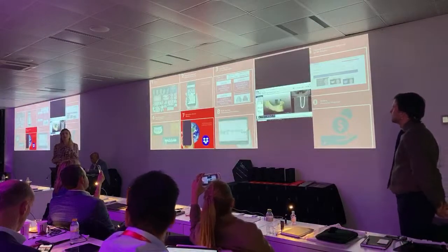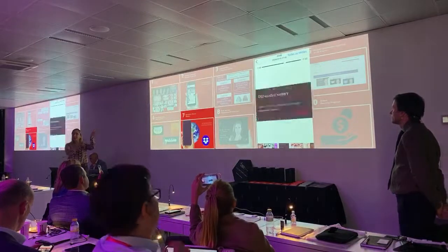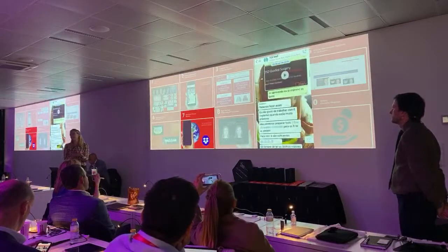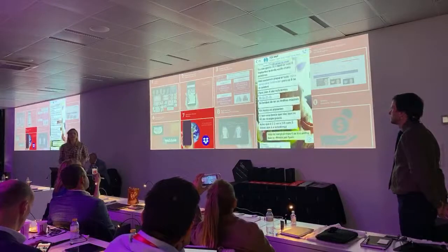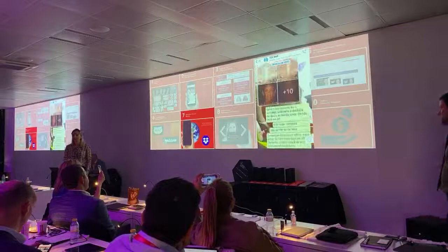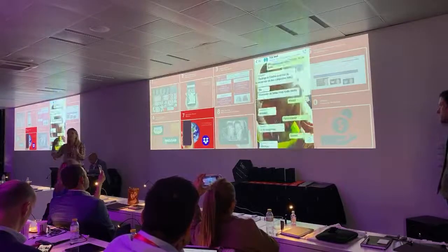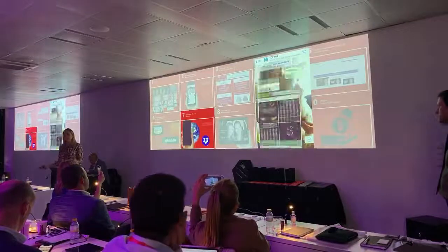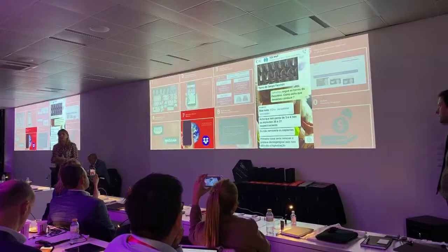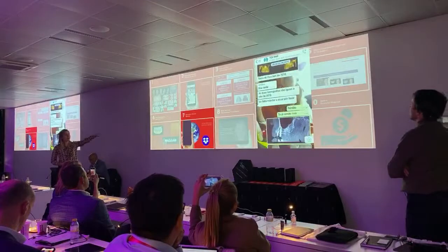So when I want their opinion, I send them the planning, the direct question, and they give me the direct answer in 5 minutes or less. If I give them just x-rays and say, look, give me your opinion, what do you think about implants in this case? You have to open the x-rays, open the pictures, think. They don't know where you want to go. They don't know the final ideal project. So it makes it difficult for them to answer you, and maybe they will take more time to give your answer. So that is why I do it like this.